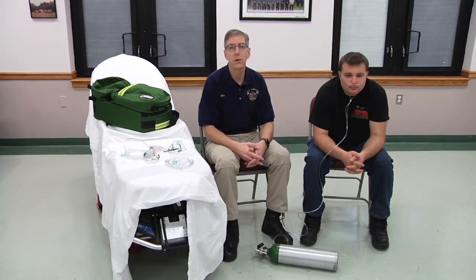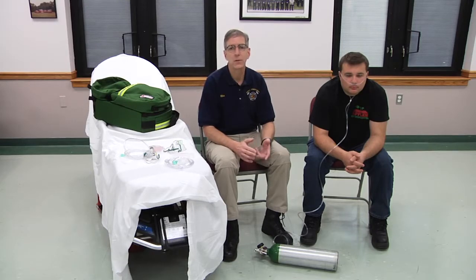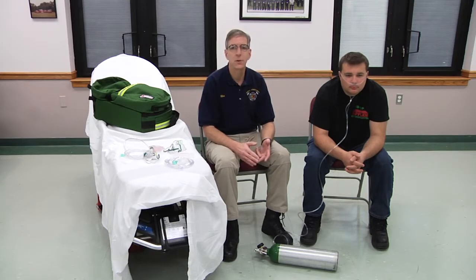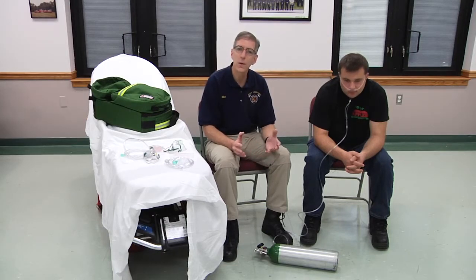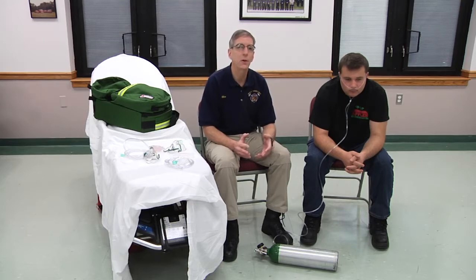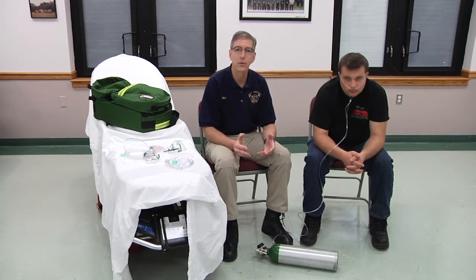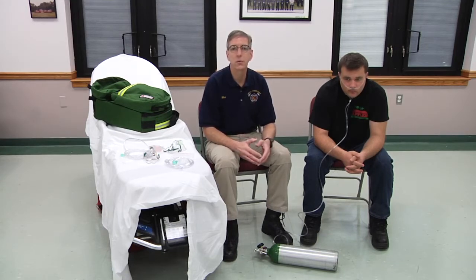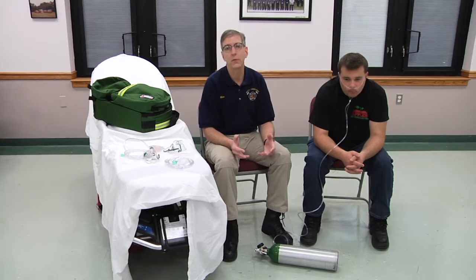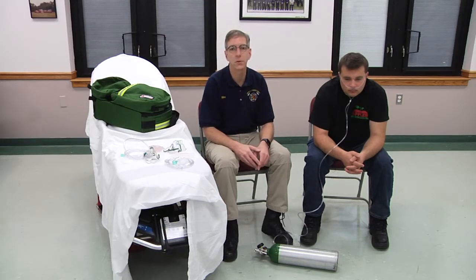We use nebulizers typically to deliver bronchodilators — for asthma, patients with COPD exacerbation, people with anaphylaxis, people with pneumonia, anyone who's wheezing, although wheezing does not necessarily occur in everybody who needs a small volume nebulizer. Your local protocols will give you indications for use. I want to talk today about some tips for actually delivering nebulized medication to a patient.